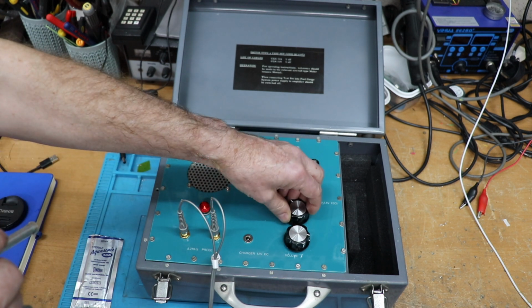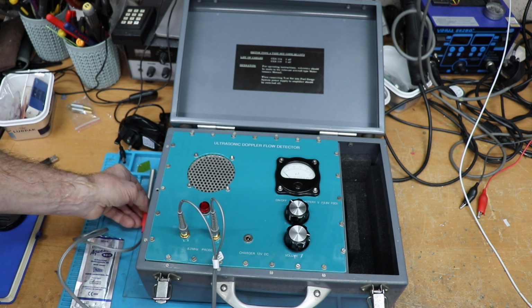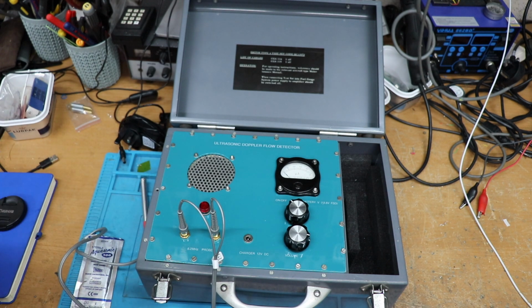Just turn it off for a minute. The actual phasicity of the waveform, what they call the phasicity, is quite important. It gives you an idea of the nature of the blood flow. So, for instance, if there's an obstruction in one of the blood vessels higher up, you get a change in the waveform, which will give you an idea if the blood flow is being restricted.